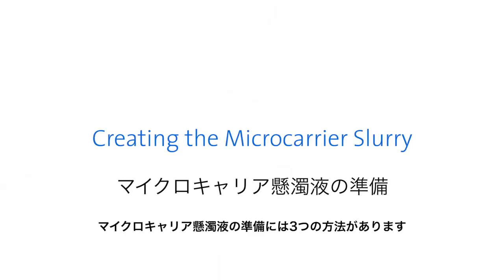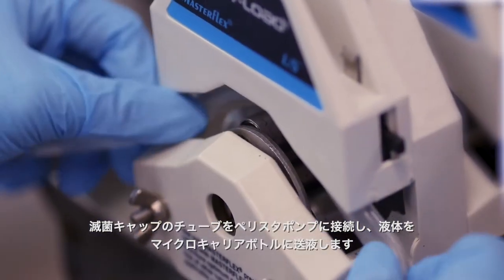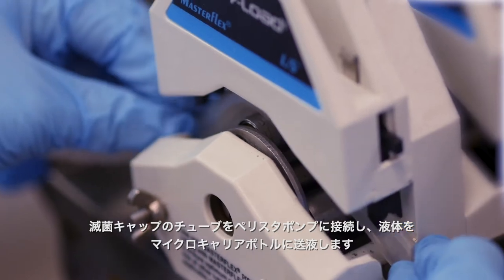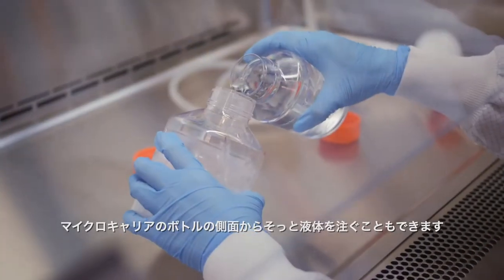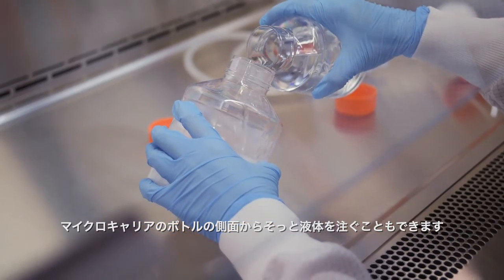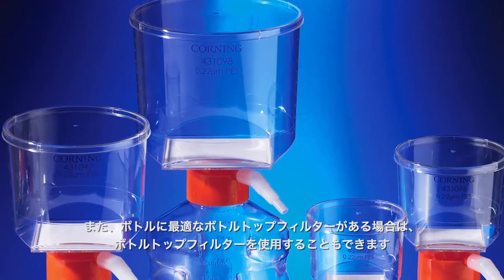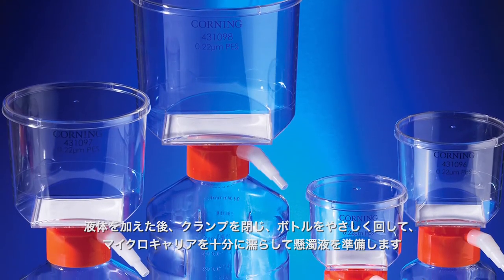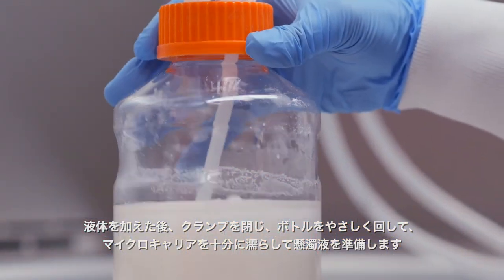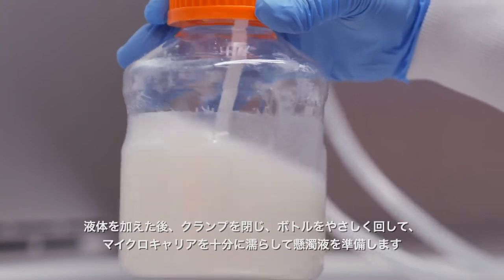There are three methods for generating a slurry. You can connect the inlet tube on the aseptic cap to a peristaltic pump and transfer liquid into the microcarrier bottle. Or you can gently pour liquid down the side of the microcarrier bottle. Alternatively, you can also use a bottle top filter if the storage bottle can be fitted with one. After adding the liquid, close the clamps and gently swirl the bottle to thoroughly wet the beads and make the slurry.